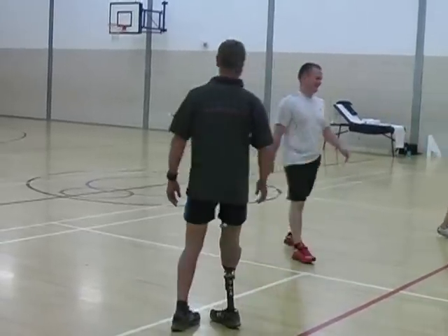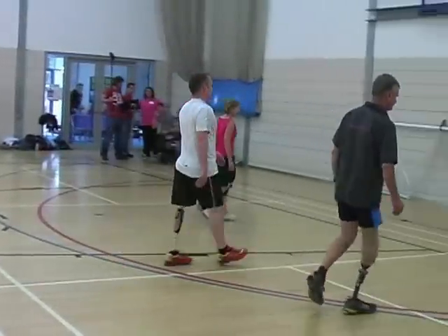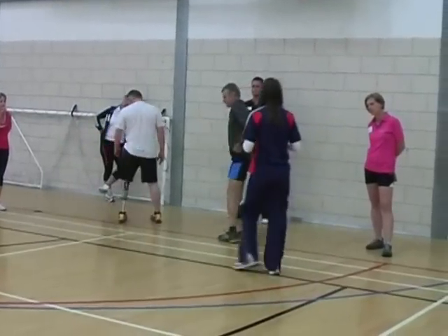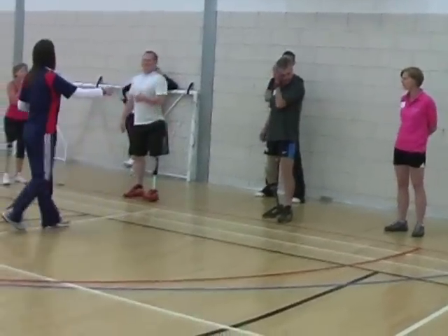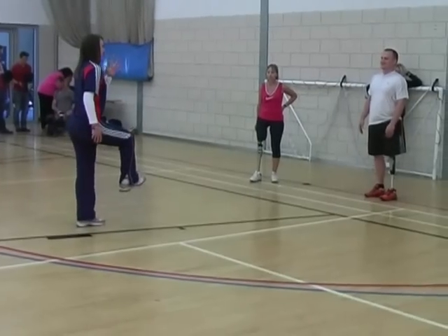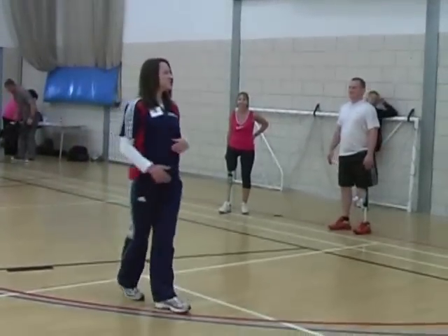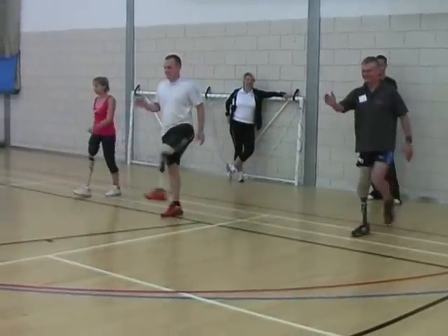Walking back through — so the people that were watching: what major things did you notice somewhere else in the body that they could do that they weren't doing that would really help them? So a bit of this. Not as much as I thought, actually. If we're using these arms to counter the balance, let's not see any tick-tocking. So it's about coordination. You don't want to think about it too much. We've found a challenge for Colin.